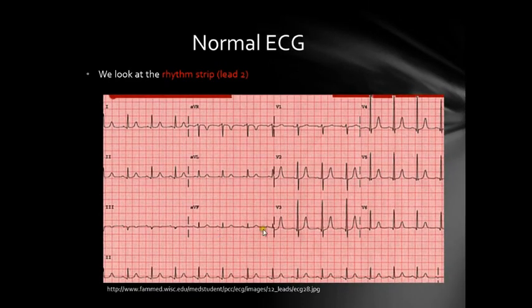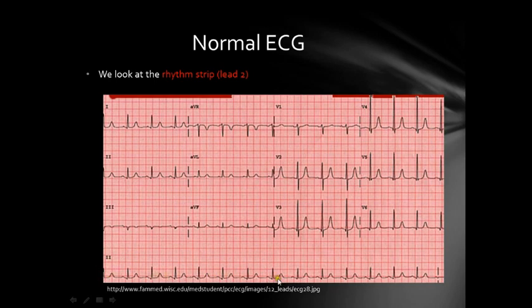This is a normal ECG. The lead we look at to identify cardiac rhythm is usually Lead 2, which you will typically see at the bottom of an ECG as a long strip — this is called the rhythm strip. Lead 2 is used as the rhythm strip because the P wave is most clearly seen in Lead 2, better than any other lead.